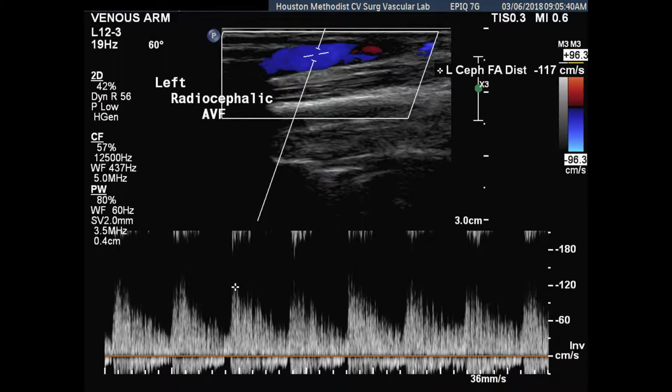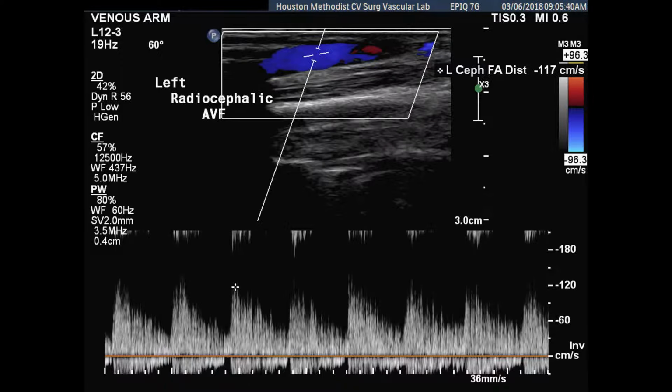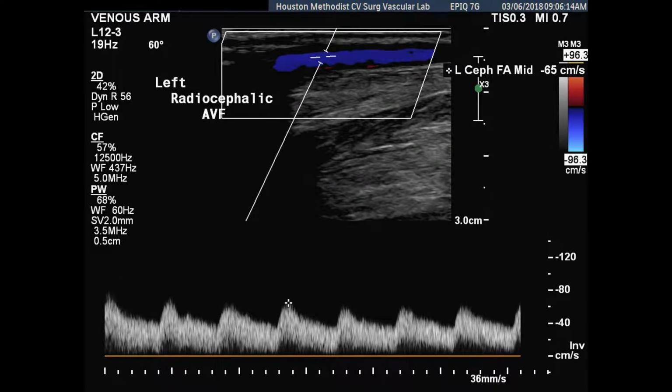That's interesting. Yep. That is where, oh, now you're talking. Now your systolic upstroke is gone. So this is where it's trying to organize the waveform. So maybe this is an unorganized waveform and we're just a little bit distal to it, but now your systolic upstroke is gone and your waveform is organized. These two images for me are really stunning, how we need to really learn how the organization of this waveform really happens.